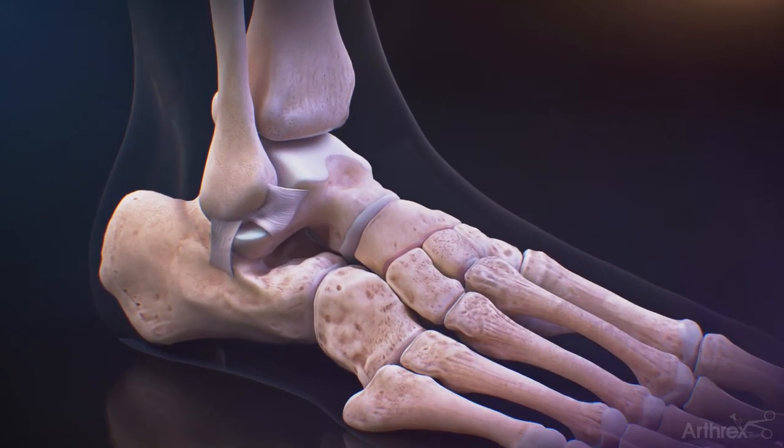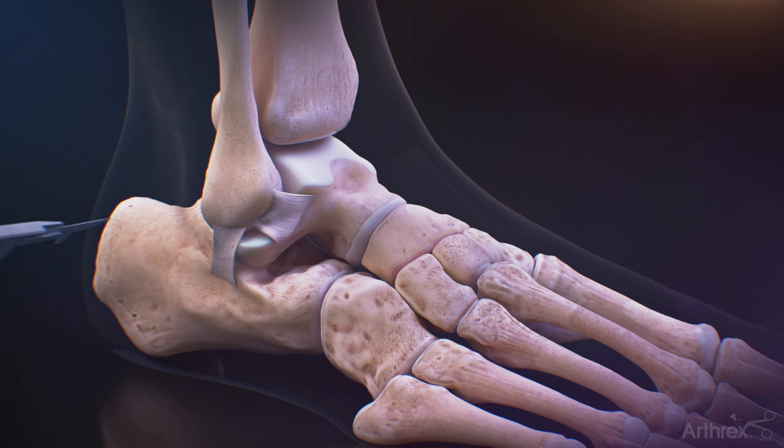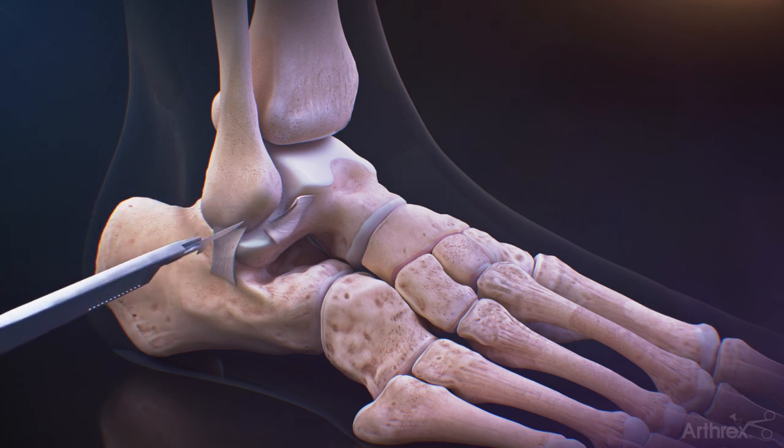When using the DX Knotless fiber tack for a Brostrum repair, the incision is made on the outside of the ankle over the torn ligament.